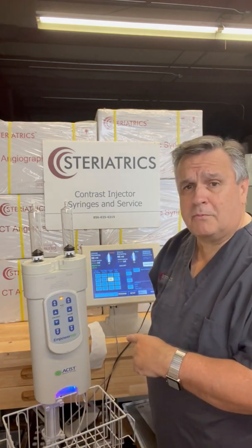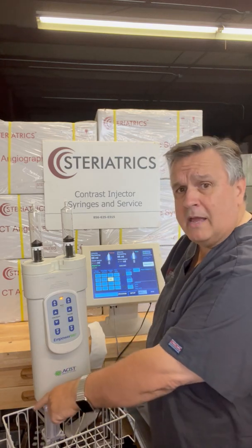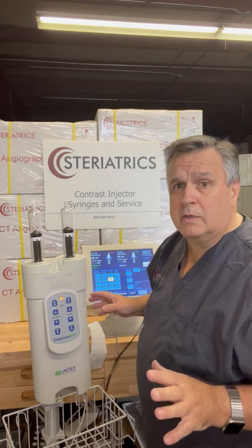Some of you might notice this sounds a little different from other injectors. That's because this is a hydraulic injector. The hydraulic panel I have sitting right here is what you're hearing — normally that would be in the computer room, so you wouldn't hear that.